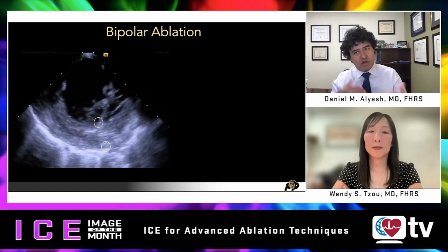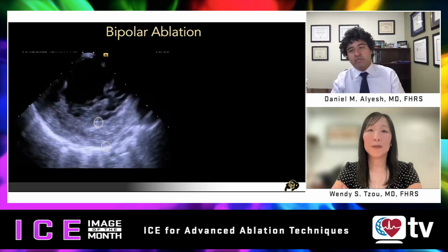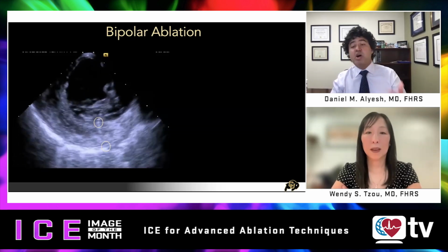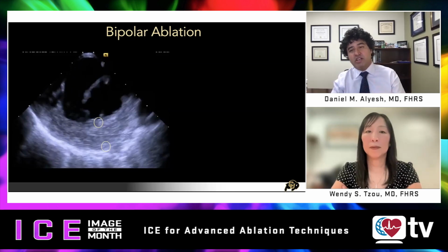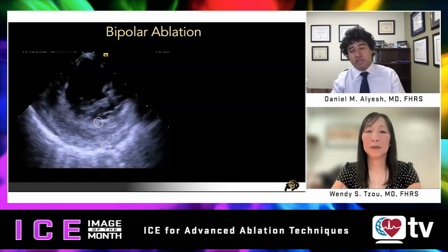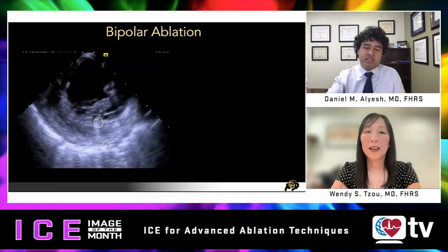And we always do fall back, I mean, I typically, even if I do see it, fall back on an angiogram. But I think it is possible. And I think especially for monitoring your lesion on ICE, it's very helpful. And so really, really cool that you can see both catheters in this circumstance.